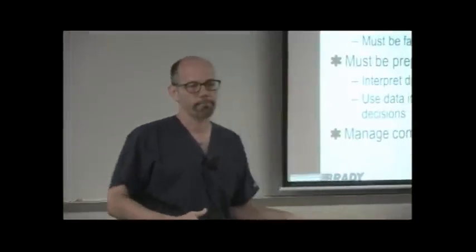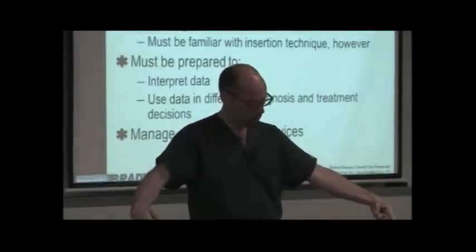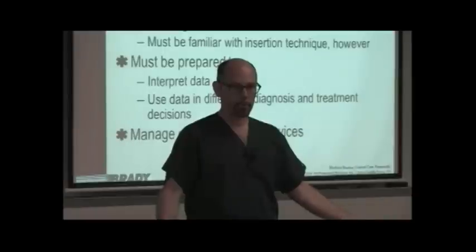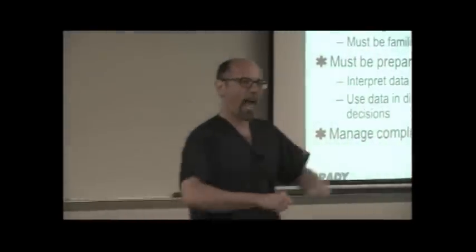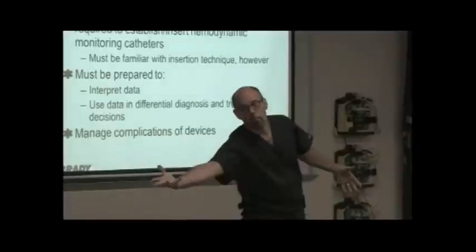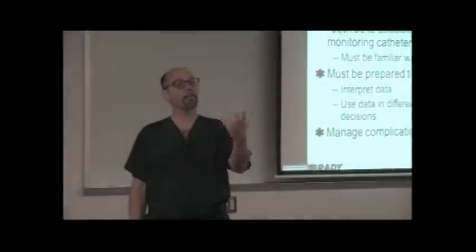So it doesn't happen. The other thing that can happen is, so the catheter is this long, and then there's an extension tubing that goes to the helium pump on the balloon. It's about that long, about 4 feet long. The balloon pump can only have one of those extensions on it. It knows that the volume of helium that it needs is that extension tubing plus the volume of the balloon. If I add another length of extension tubing on there, I decrease the amount of helium that gets to the balloon. So it's not going to hurt the patient, but I'm not going to benefit the patient as much as if I fully inflated that balloon with each diastole.